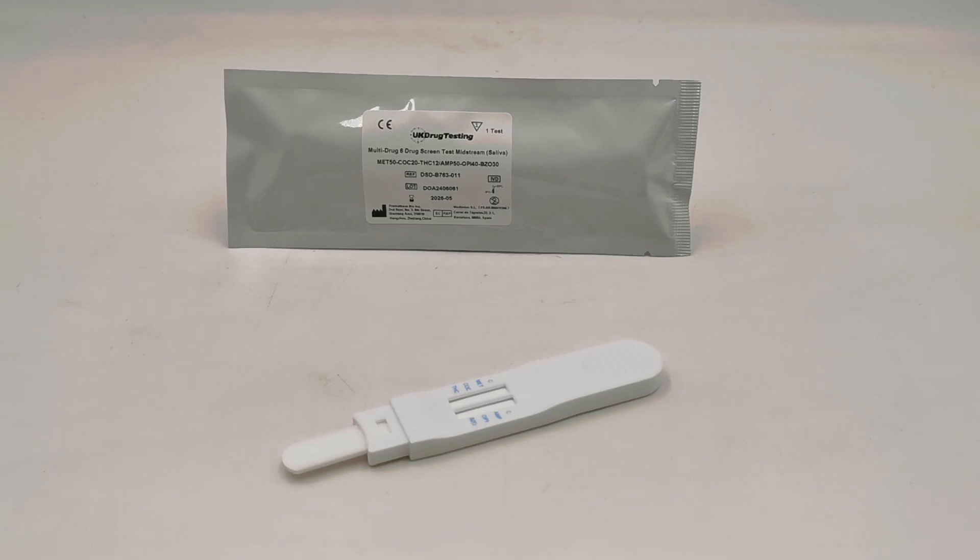The test can be left in the pool of saliva for between 30 and 45 seconds, then ask the donor to move it around the mouth, rubbing the gums, teeth, and top of the tongue. It can then be left in the oral cavity until both control lines show. A negative result can be read from as early as four to five minutes, but for a positive result — indicated by a control line with no test line against the drug abbreviation — you must leave a full 10 minutes.